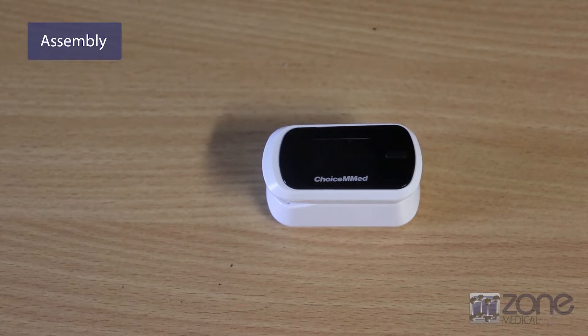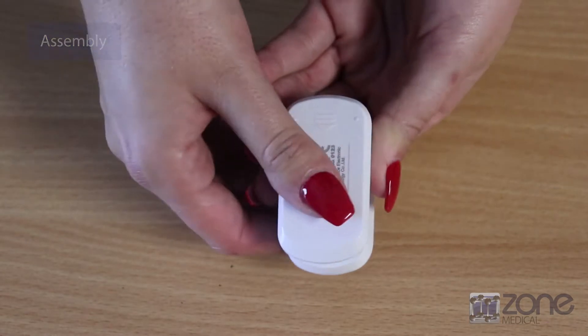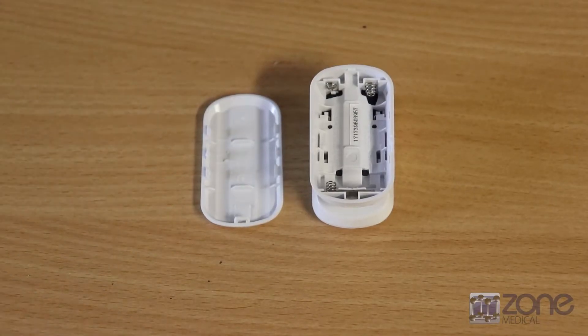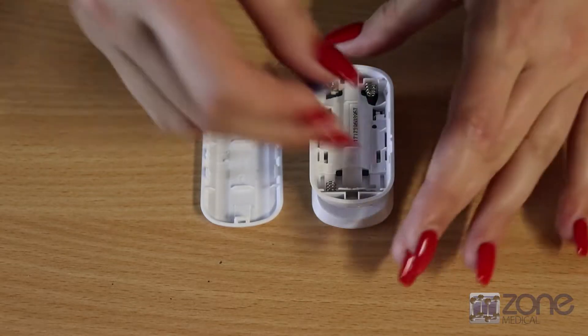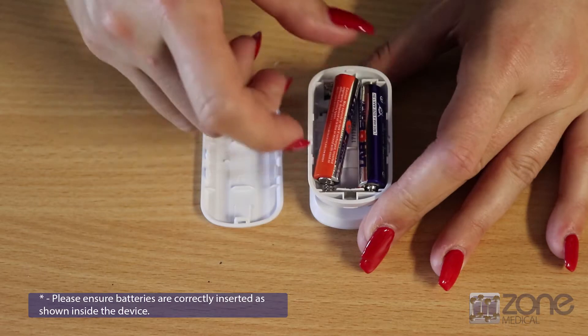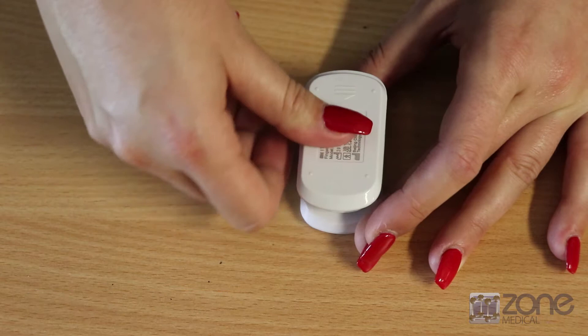To prepare your pulse oximeter for use, you will need to insert the batteries. You can do this by flipping the device over and opening up the backing case. Then insert the batteries as per the molding on the back of the case, ensuring the positive and negative charges match up to what is on the housing.